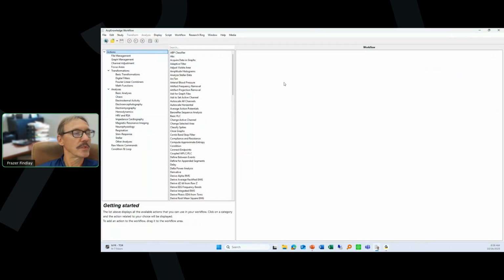Okay, right. Yeah. So here we've got a graphical user interface that allows you to create a workflow. And the workflow will basically mimic the steps that Alex demonstrated in order to prepare the data to the point of analyzing it and then running through the analysis. On the left-hand side, we have all the actions that are available within the software.